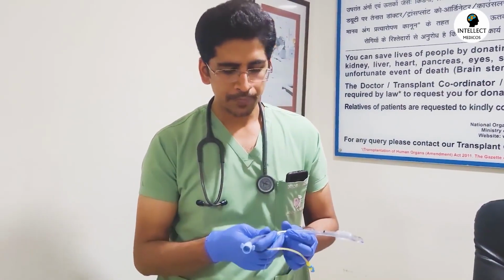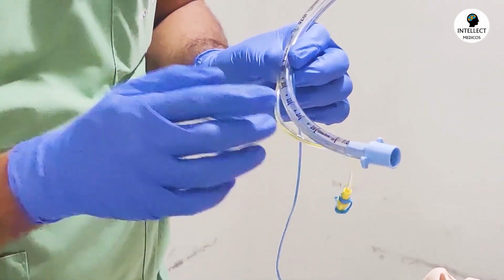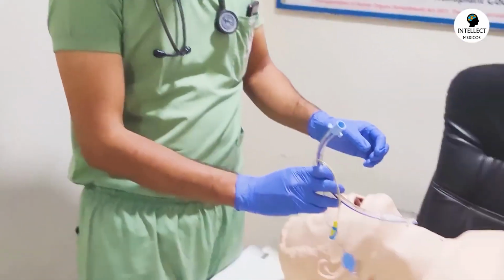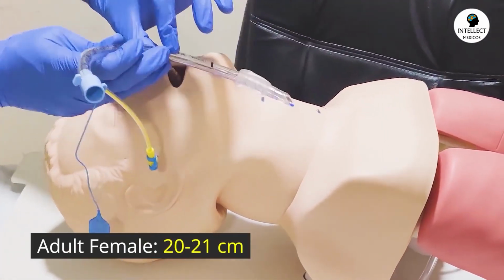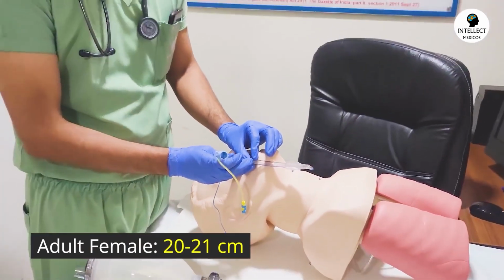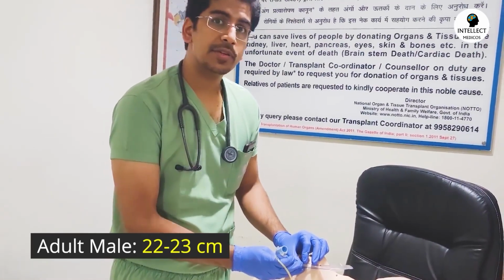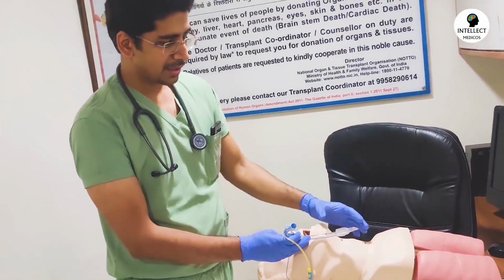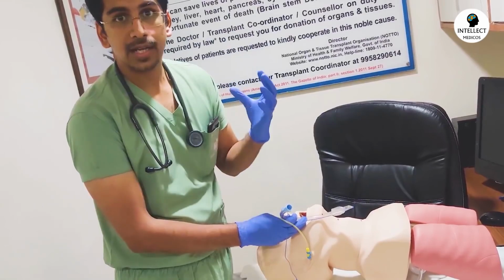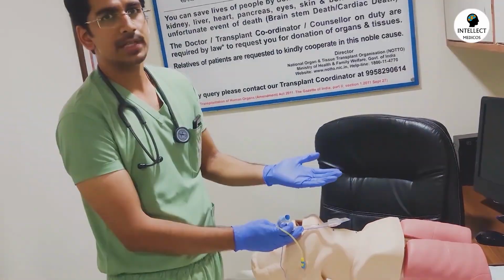And then talking about the depth, how much you need to insert this endotracheal tube. There are various marks as we discussed: 18, 20, 22, 24, 26. Then, when you are inside the trachea of a patient, in an adult female, we prefer to fix at the angle of the mouth around 20 to 21 centimeters, whereas for an adult male, we prefer to fix at 22 to 23 centimeters. That depends again on the patient profile. If the patient has a short neck, then the depth to be inserted is on the lower side. So that depends on the patient again.